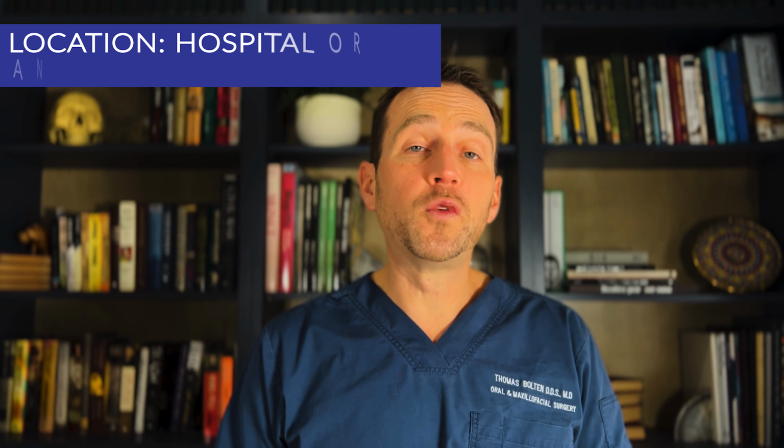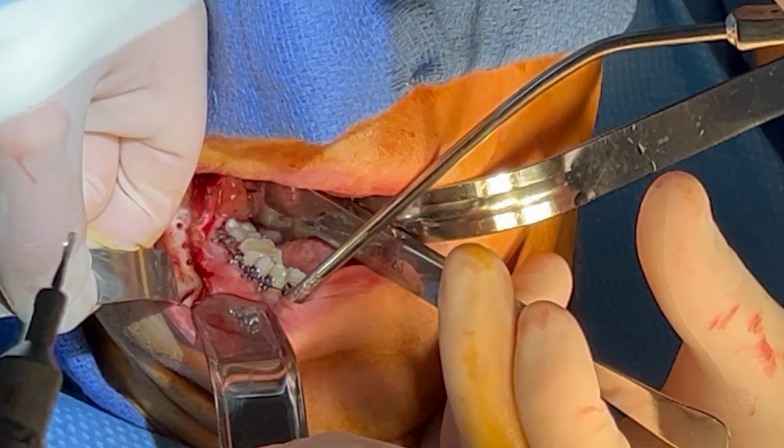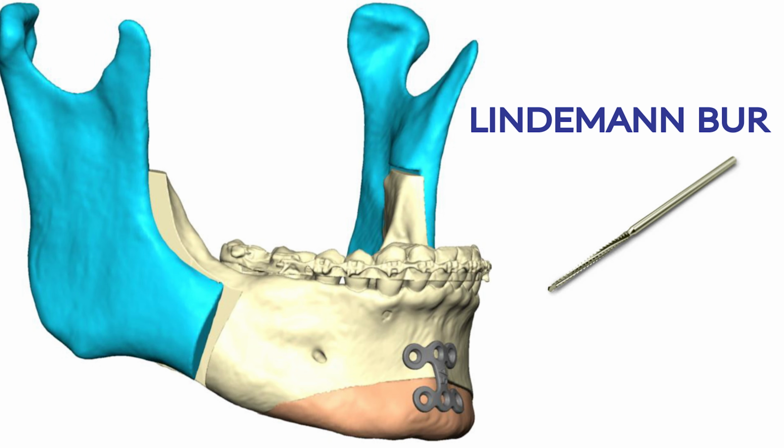This procedure is performed in the hospital under general anesthesia. After sterile prep and draping, I begin with the bilateral sagittal split osteotomy. A mucoperiosteal flap is raised to expose the mandibular ramus. I use a Lindemann burr to make the medial and vertical bony cuts.